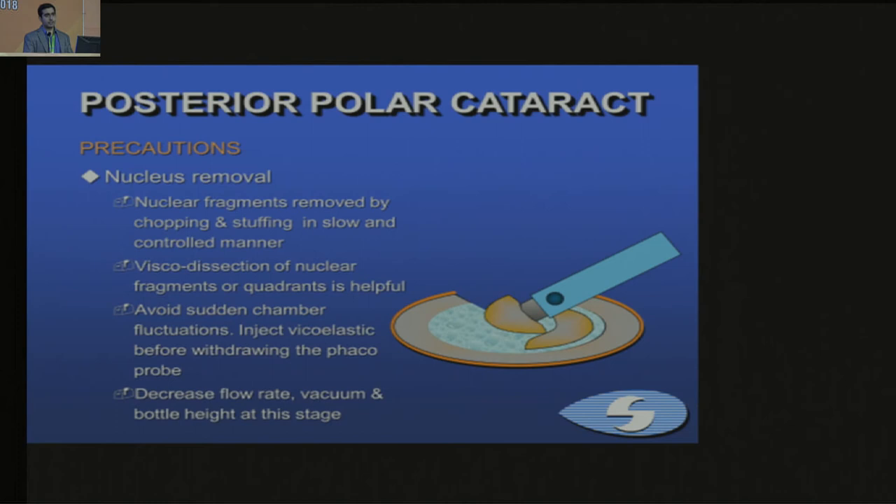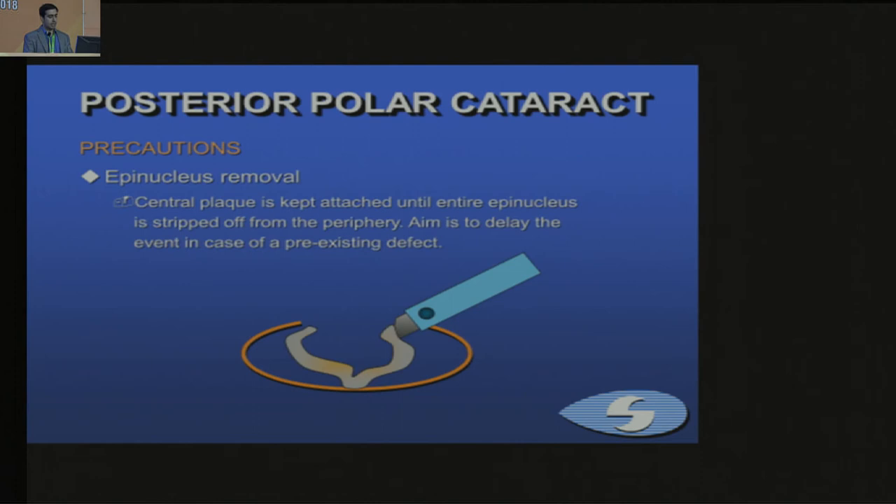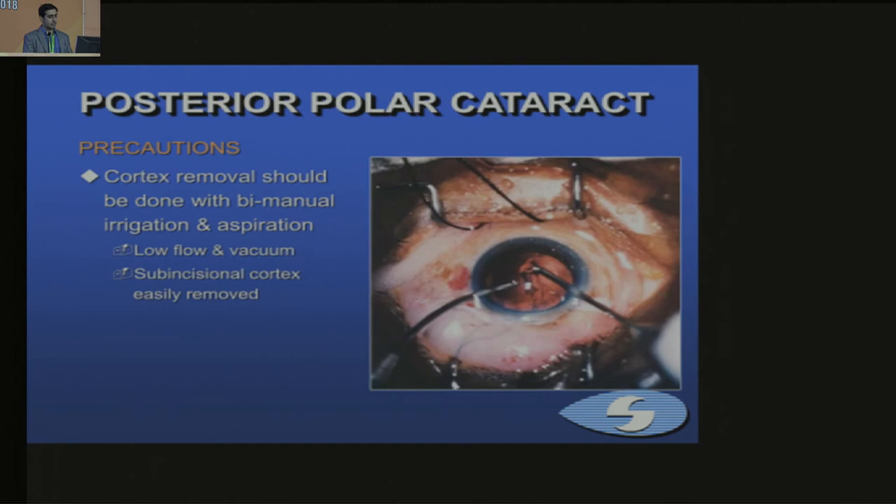Avoid chamber fluctuations — inject viscoelastic whenever you withdraw the phaco probe, and keep the flow rate, vacuum, and bottle height lower at these stages. The epinucleus should be removed at the end, separating it from all corners and then at the last minute pulling the central part, so that in case there is a rupture, it is a small rent. Cortex removal should be done by bimanual irrigation and aspiration at low flow and vacuum, removing sub-incisional cortex slowly as well.